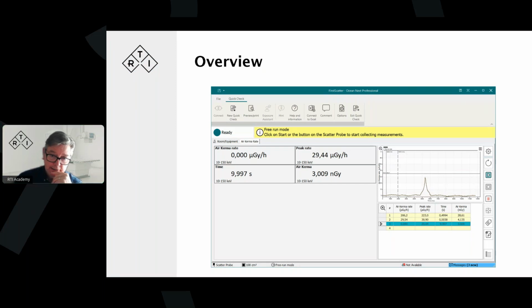It is tempting to move around and sniff around with the probe manually like this. I've seen customers do that with the traditional survey meter, the ion chamber based one that looks like an iron, and you move it around. Now you need to factor in the response time again.